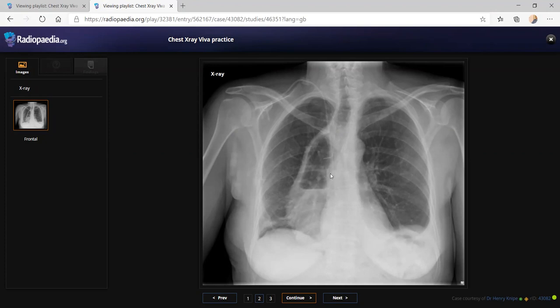Okay. So I don't ask direct questions like, is there a surgery? You have to find out the inferences from the film itself. Correct. So that will reduce your points. If you have found out the surgical clips yourself and found that answer, you will be getting an 8. Otherwise, you will be getting a 6.